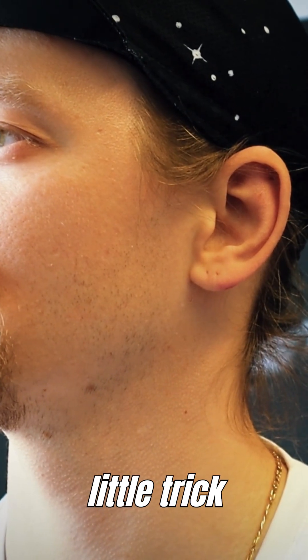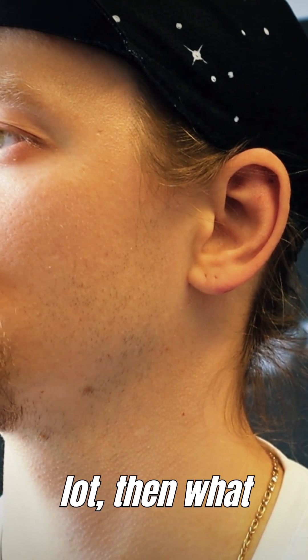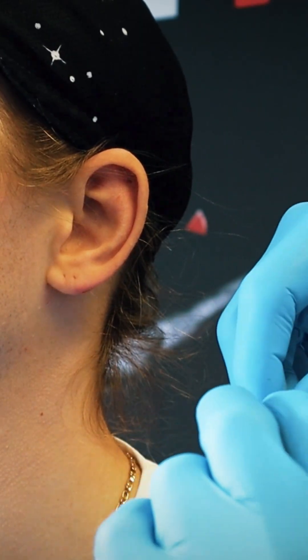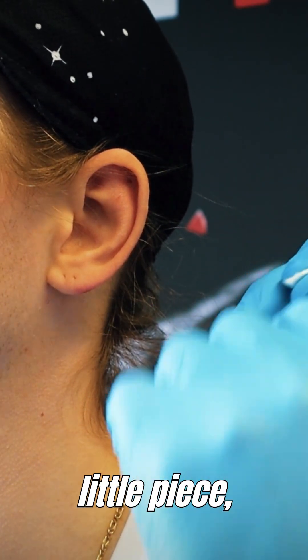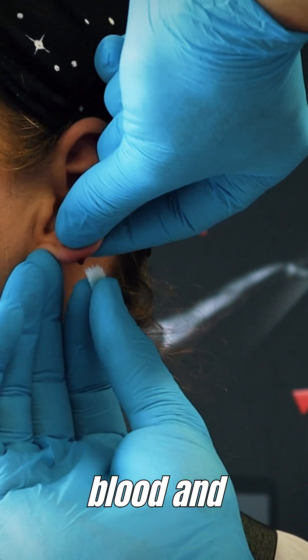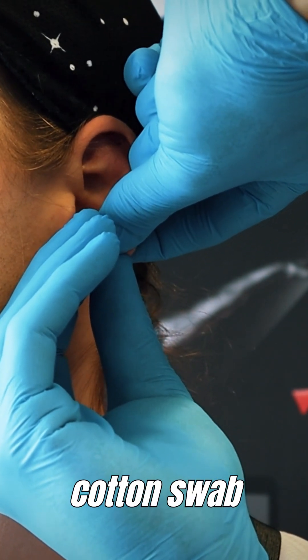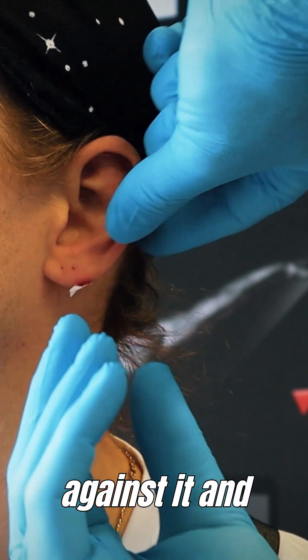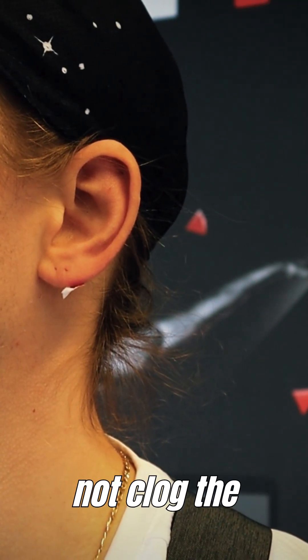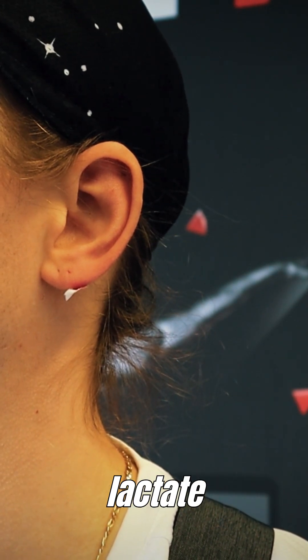One little trick: when you have a subject or client who is bleeding a lot, you can take one of your cotton swabs and tear off a little piece. Use the triangle again to get a little drop of blood, and press this piece of cotton swab against it — it will hold and stop the bleeding. It will also not clog the opening until the next lactate sampling.